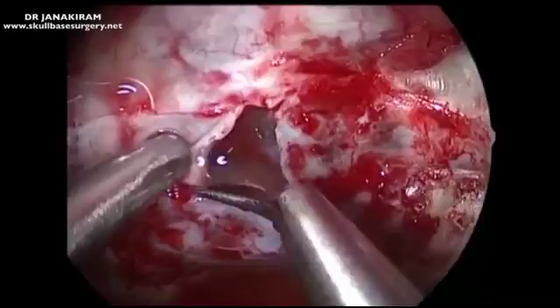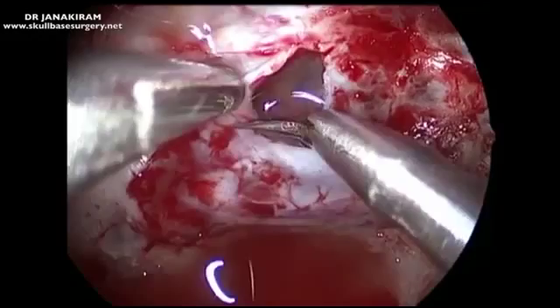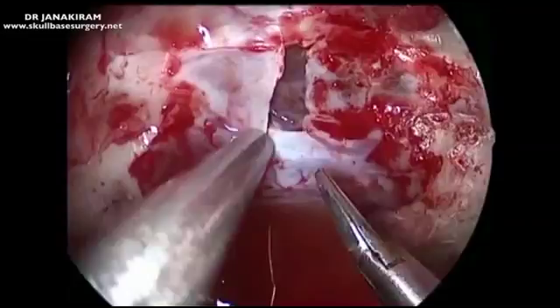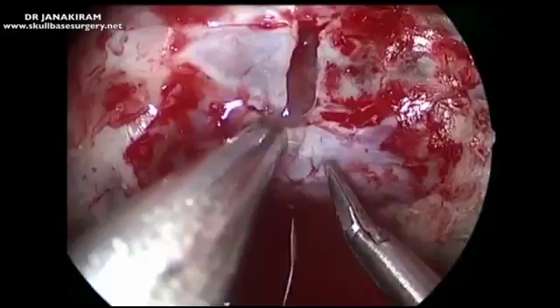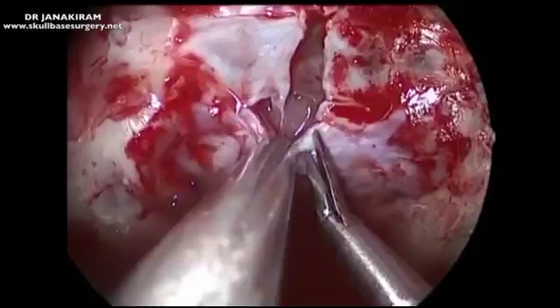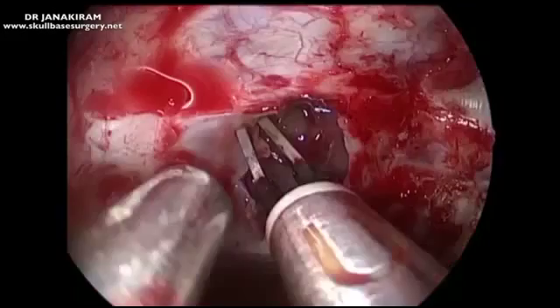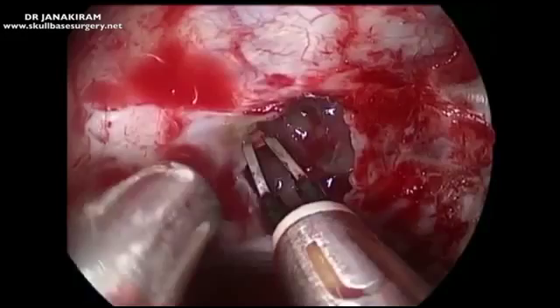You can see that I am raising a sort of a heart-shaped flap. The most important advantage of an endoscopic cranial procedure is that when you approach from below you can see the superior hypophysial artery, which we cannot see from above. The first structure we want to save is the superior hypophysial artery because it gives the recurrent optic branch, which is an end artery. If we cut it, the patient becomes blind. That is the major advantage of the trans-endoscopic procedure.